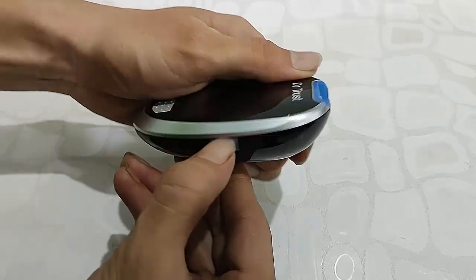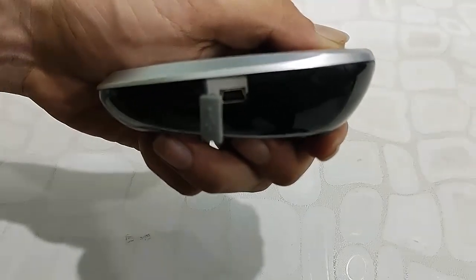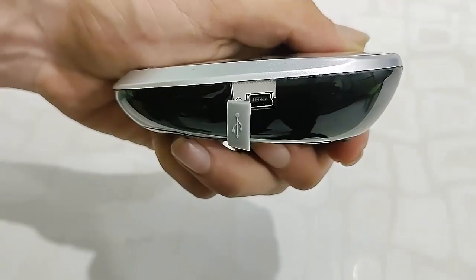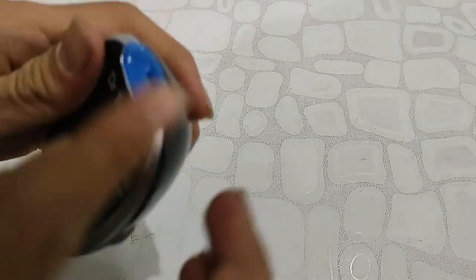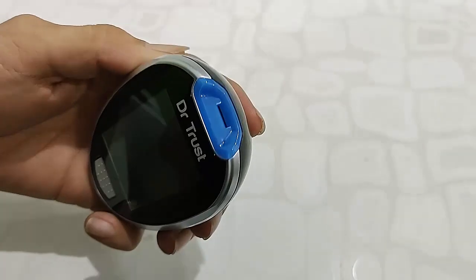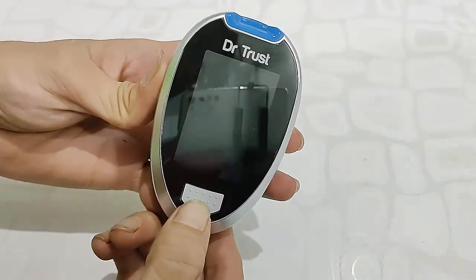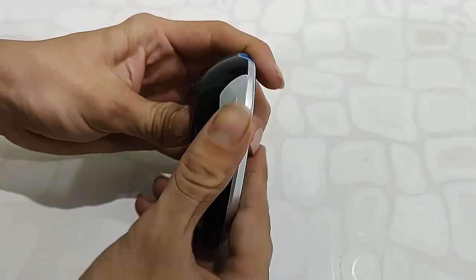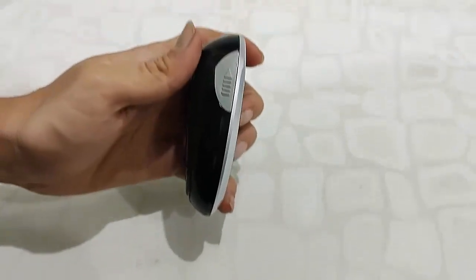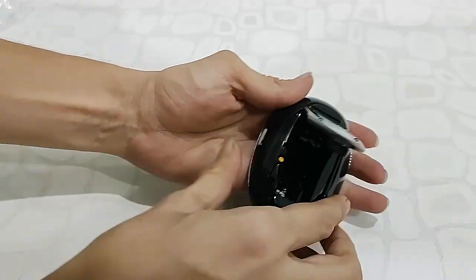A cable is included to transfer data from the device to your PC or laptop. It has good build quality, good finishing, and a big display. There's one main button to control and configure settings, and another button to safely eject the lancet needle. There's also a battery compartment.